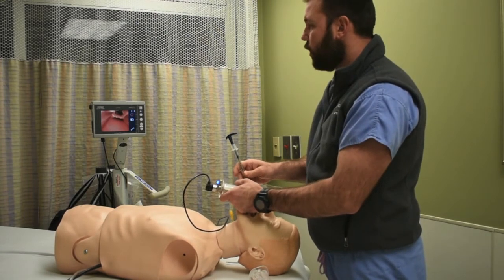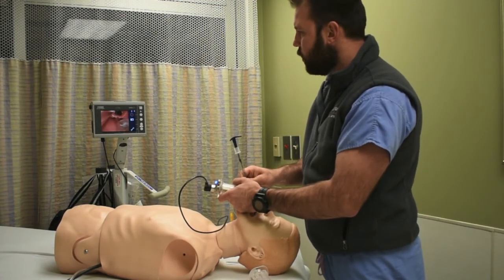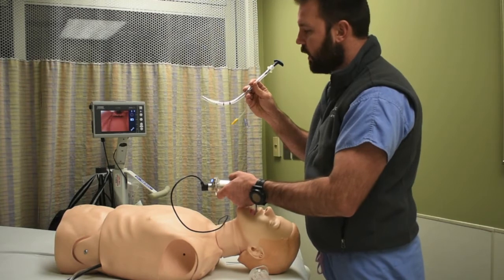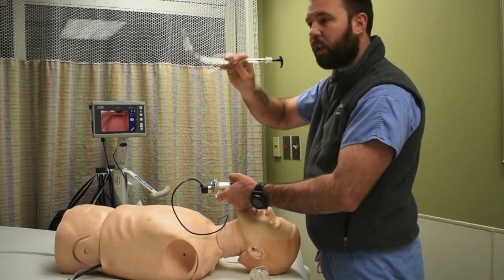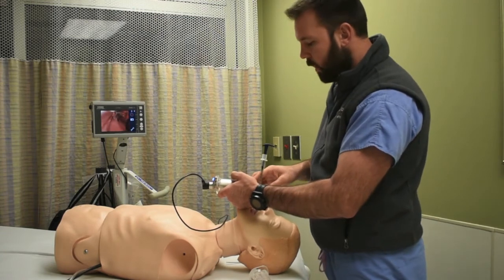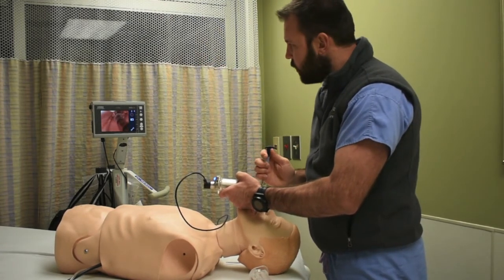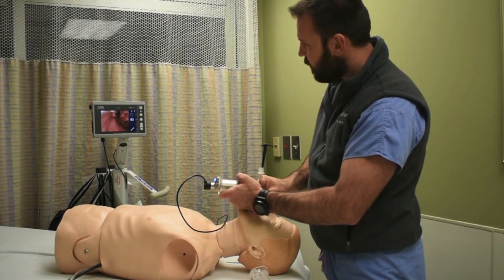Alright, now if you get in here and you're too close, you'd be past the vallecula at that point, so you shouldn't be there, and you can't get the tube to go in, you need to inch back away from the vocal cords so that you can allow the hyperangulation of this stylet to do its job and curve up past the tip of the D blade, as you can see. Now, with the hyperangulation, once you get into the vocal cord area, you actually start to go ahead and hit the top of the airway. So once you're through, you may have to use your thumb to back the stylet out slightly and then advance that tube in further.